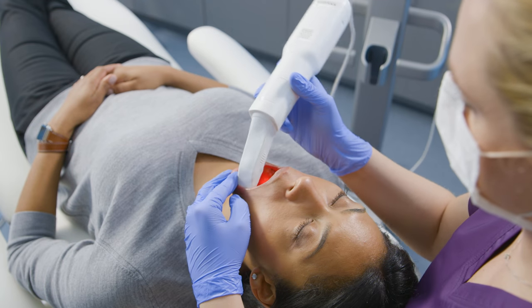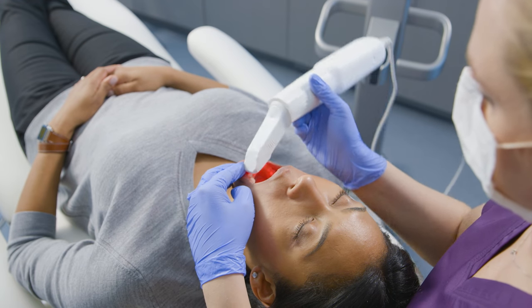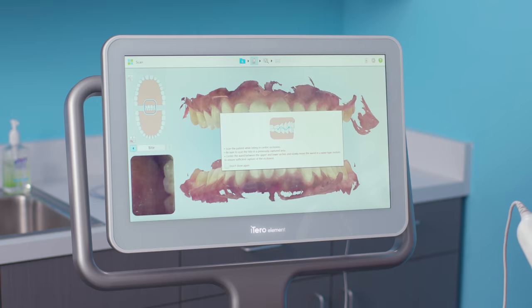I use a rocking motion while scanning the buccal and a rolling motion while scanning the lingual to capture the interproximal surfaces, pointing the tip of the wand toward the anatomy I'm intending to capture.